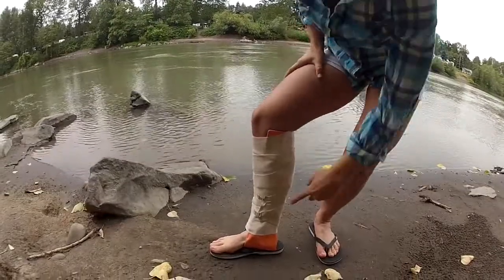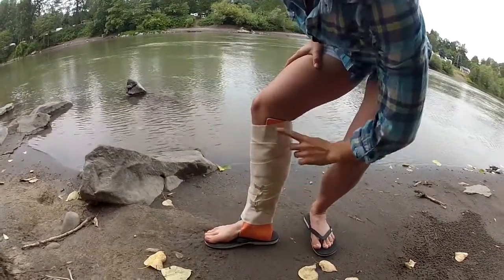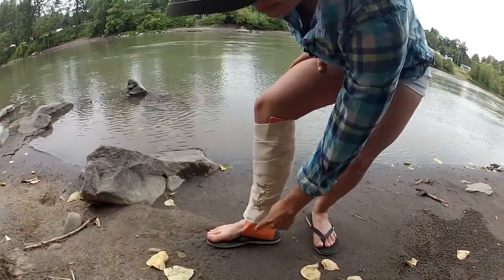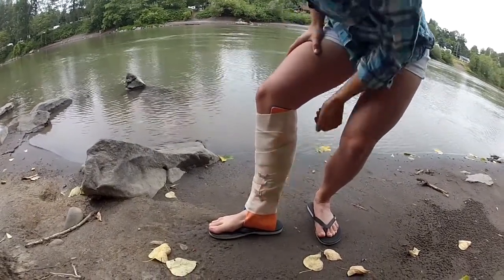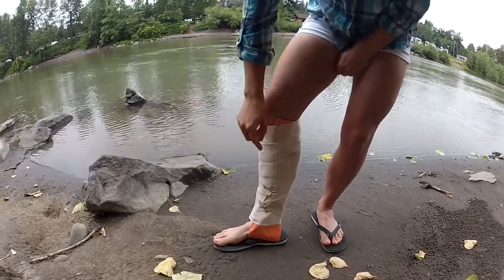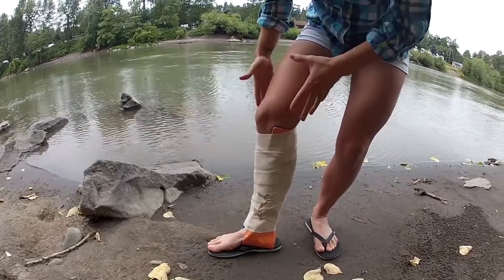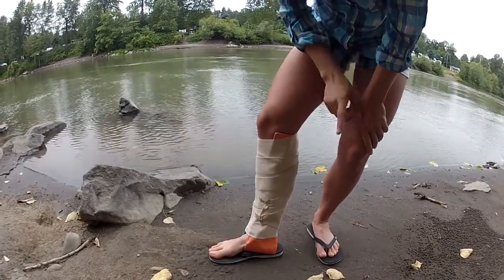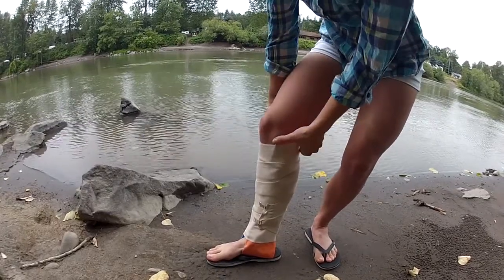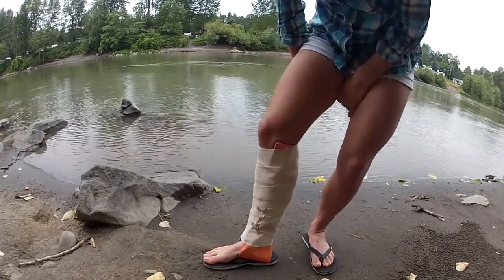Here are some more examples of how to use the SamSplint. For an ankle injury or an injury to the lower leg, you can use the SamSplint and wrap around the foot. This secures the bones in the foot and above the ankle, immobilizing the ankle. For the lower leg, it's a little trickier to immobilize the full knee. This is typically done with two SamSplints, but if you only have one available, you can wrap it the same way and extend it as far up to the knee as you can.